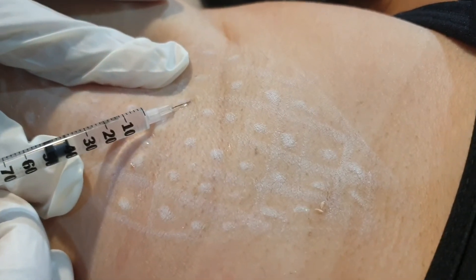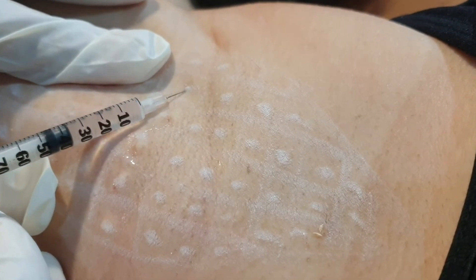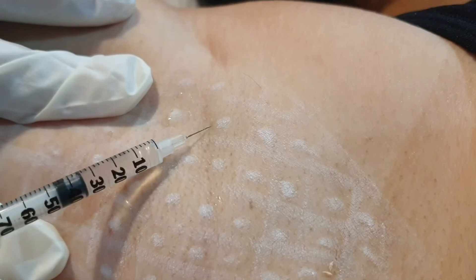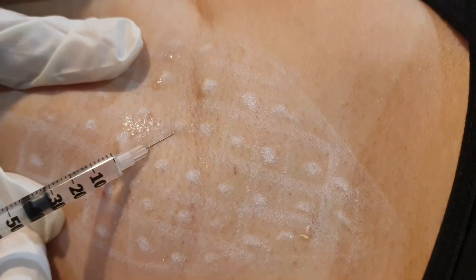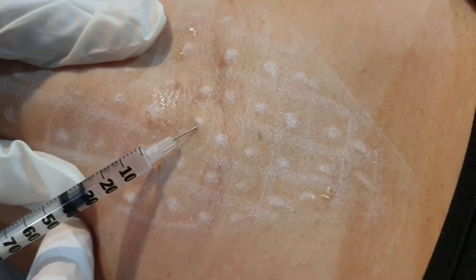Between the points — this is okay. Very superficial injection. It is also more effective when we are very superficial.